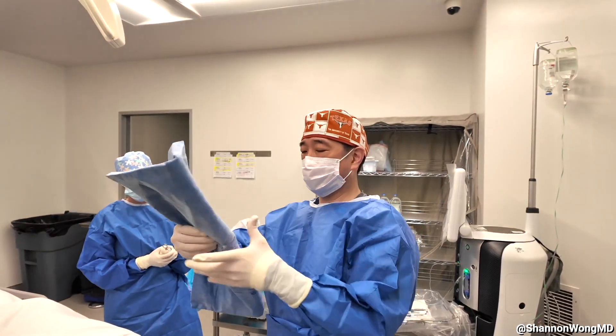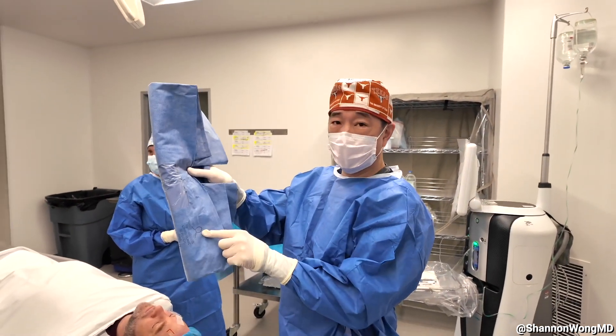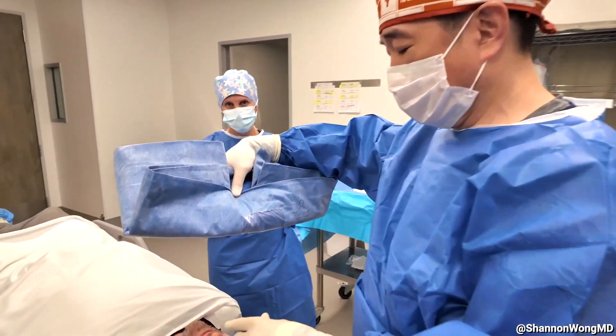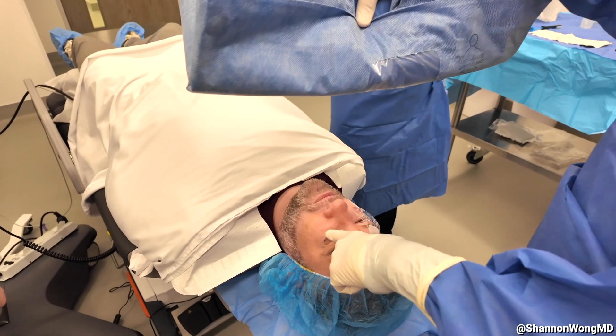Again, pay attention to the figure of the human on the drape and make sure that the top of the drape is toward the patient's head.